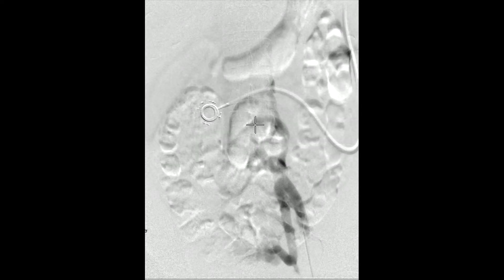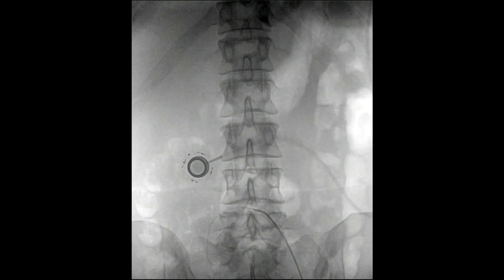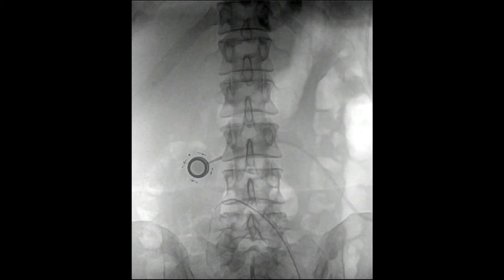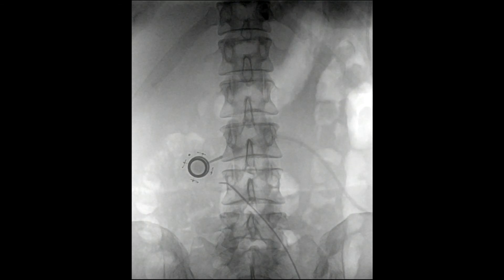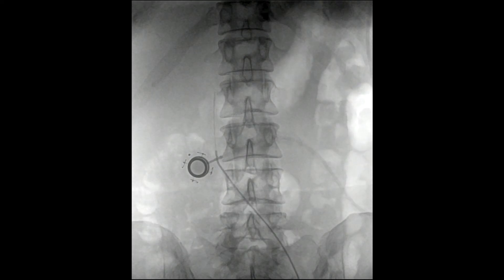So clearly she had near total occlusion of the vein. We had also planned to do the left renal venogram at the same time. The catheter and wire were first advanced up into the inferior vena cava. You can see it advances over the contralateral iliac vein, then we advance a curved catheter, pull the wire back, and deflect the catheter up the inferior vena cava. Over that wire we then advance the catheter. We changed it out for a C2 catheter, which is my catheter of choice for accessing the left renal vein.